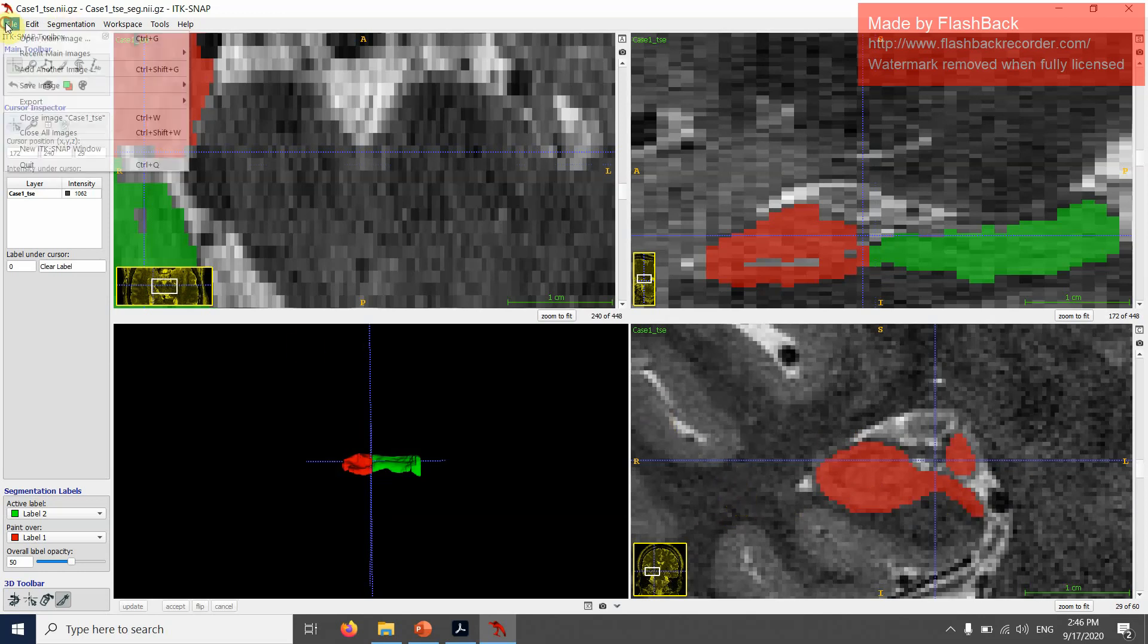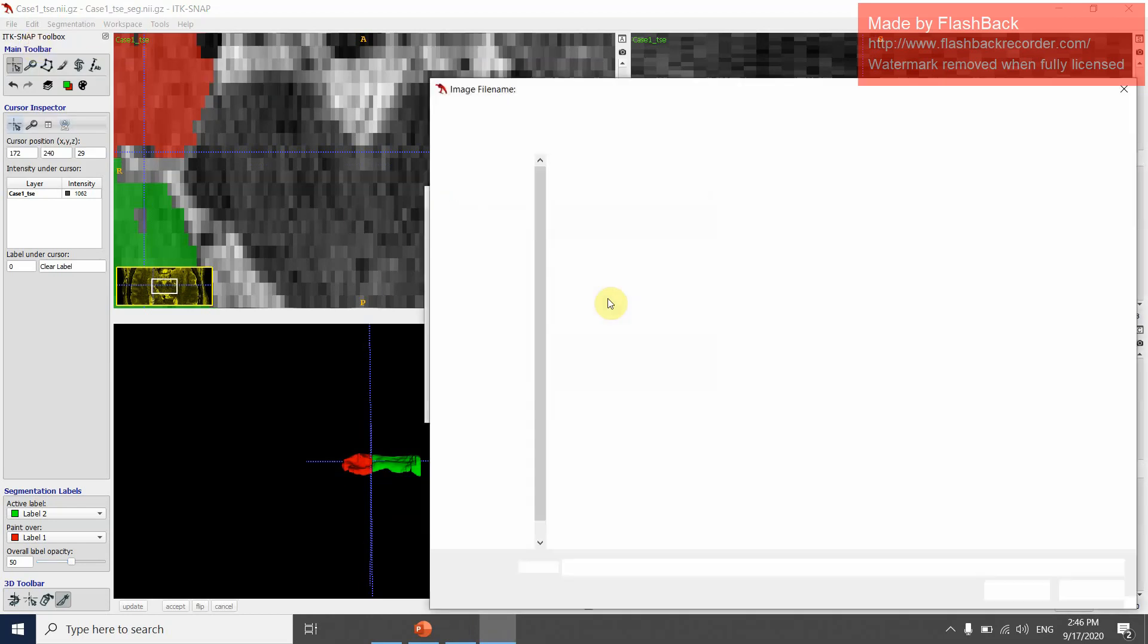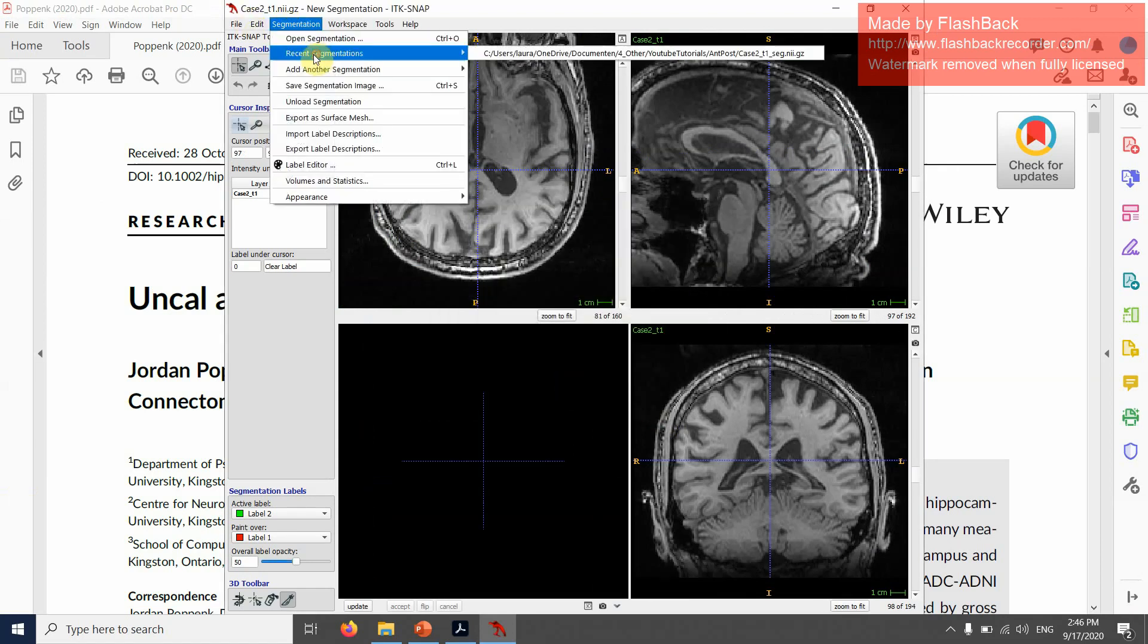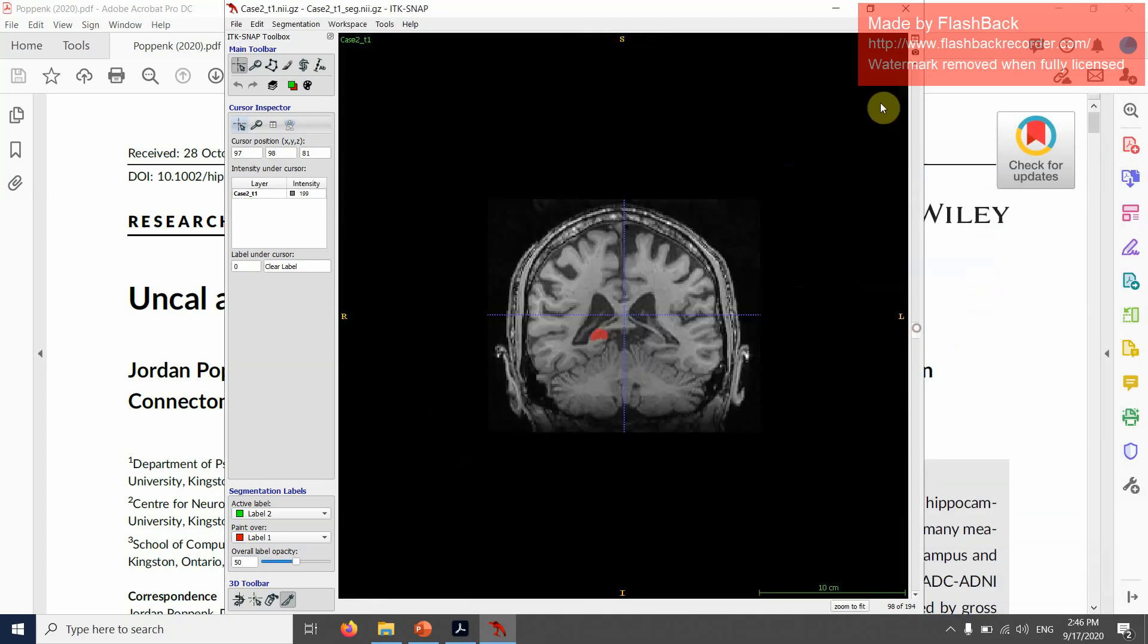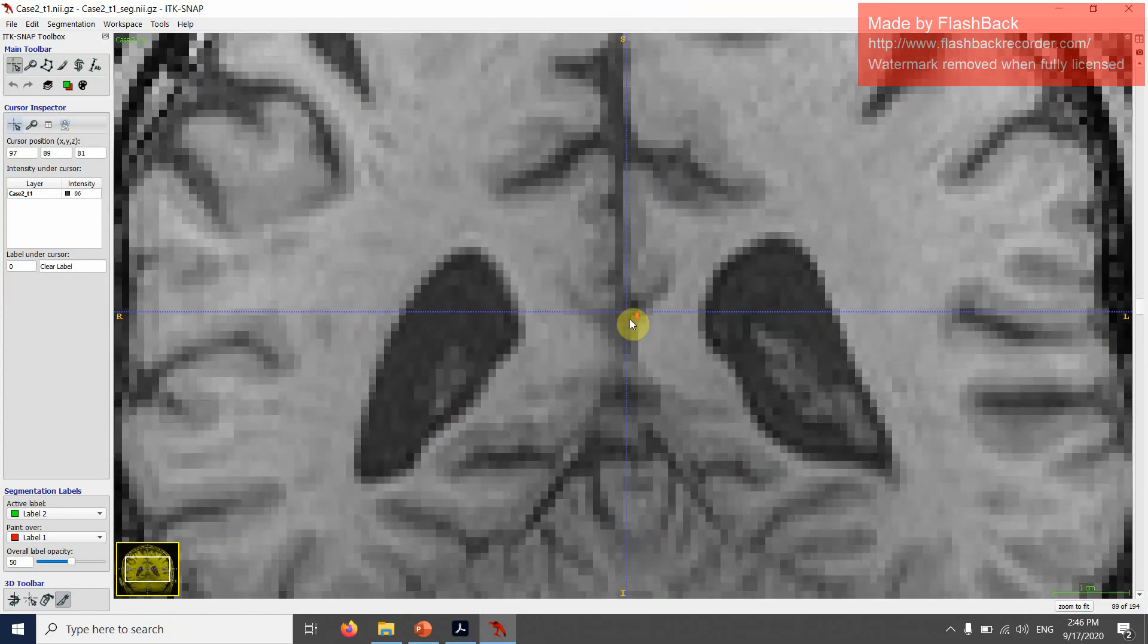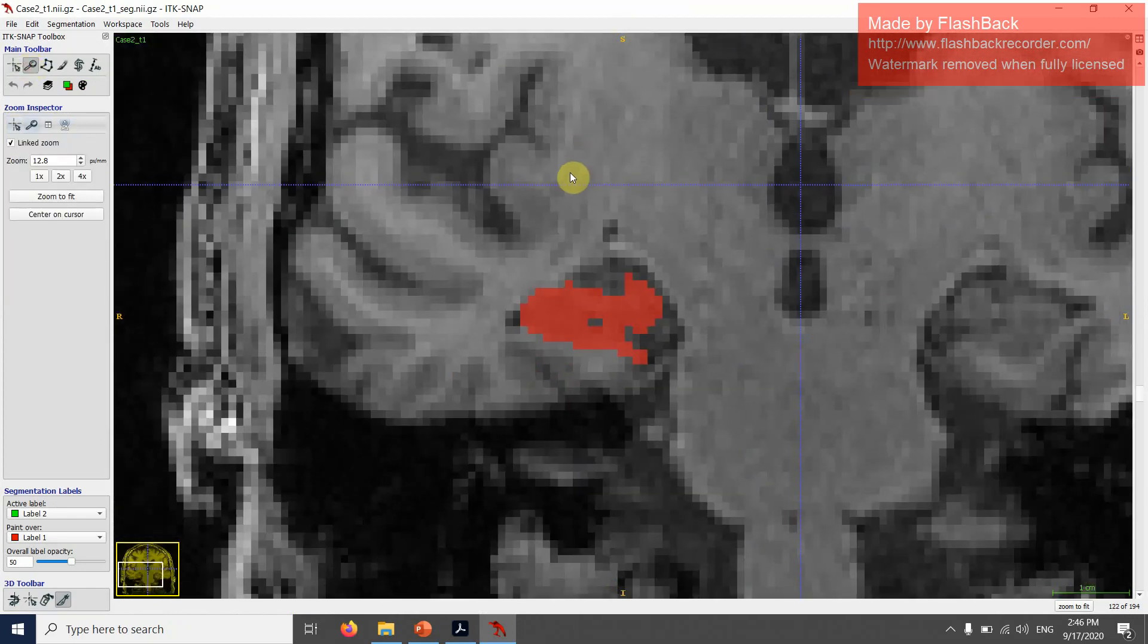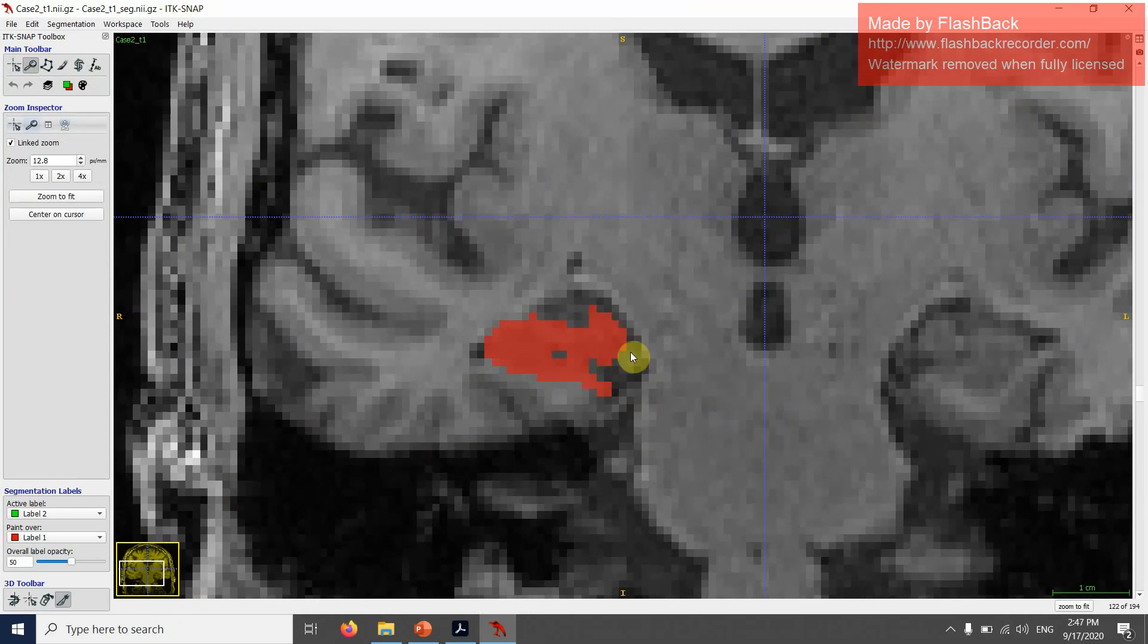I'm going to show you another example. This is a T1-weighted MRI and I'm going to only look at the right hemisphere in this tutorial today. Again, this is lateral, this is medial. I already have the hippocampus segmented and this part here is the uncus.